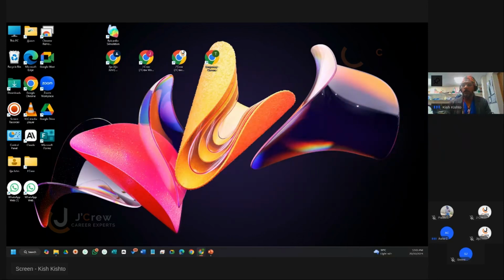Okay, so let's start with the dissection. The dissection is predominantly the best part. So I know there is AR. If you go quite high up a bit, remember when I was saying where we measure the ascending aorta. So if you go one rib space above in your parasternal long axis view, that's where you will have a better view of your ascending aorta. When you have it there, that's where you put your color, and that's predominantly the best view for you to see any flaps around. Okay, so that's one.